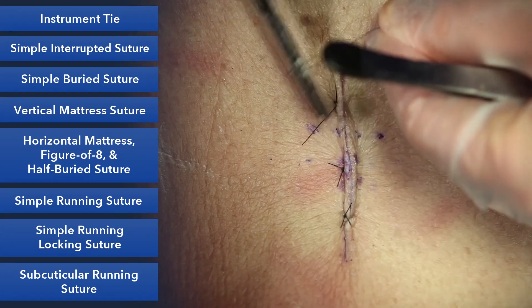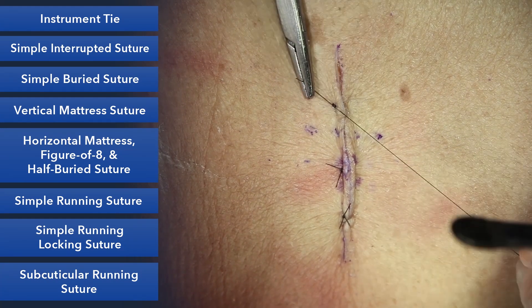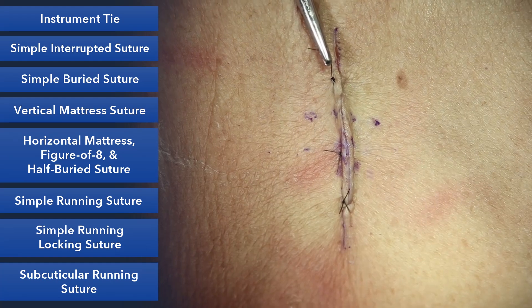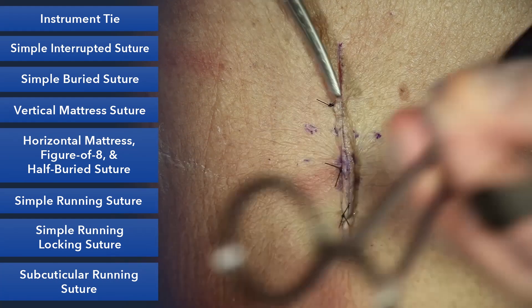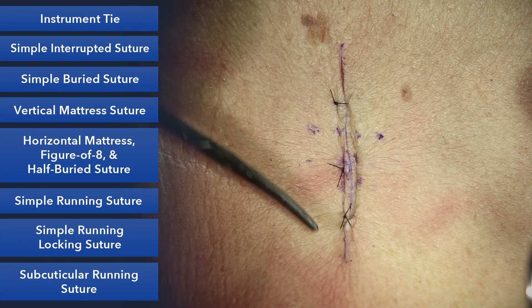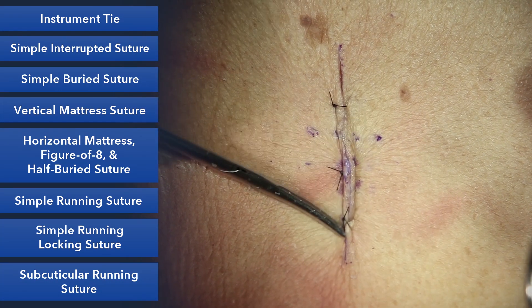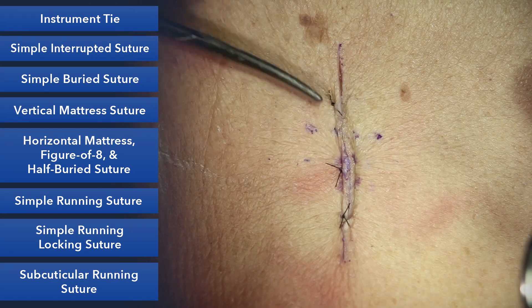You'll see us do this when we have a hair-bearing area and a non-hair-bearing area and we want to hide the suture marks, or if it's at the very end or tip of a flap and we're afraid that putting sutures in the tip is going to interrupt the blood supply. So our three variants of a horizontal: the straight horizontal mattress, the figure of eight, and the half-buried horizontal mattress.